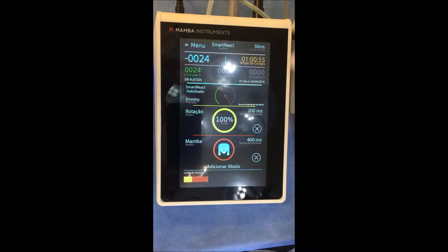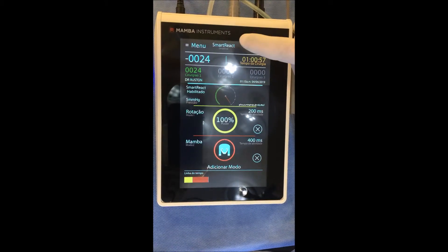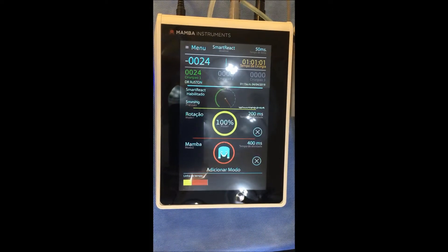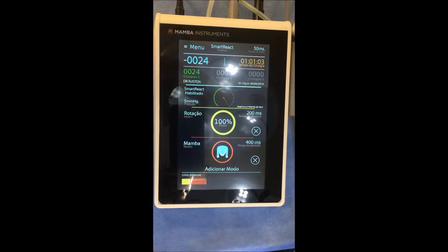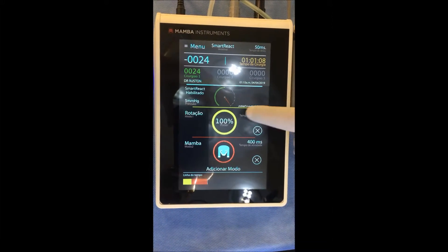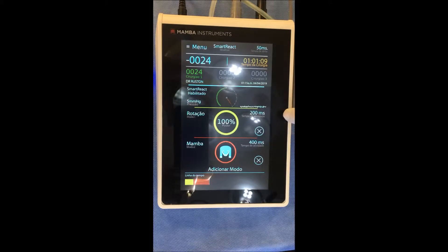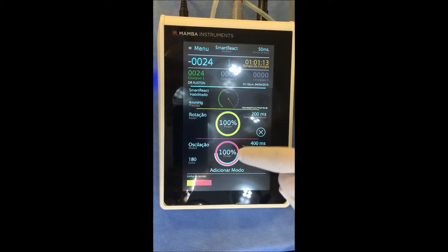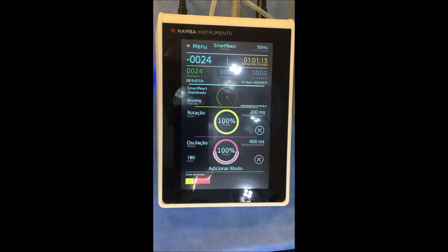So this is my personal setting: smart reaction at 50 milliseconds. But I repeat — to go this fast, you have to have a lot of skill and practice, so I would suggest decreasing little by little, starting with rotation 200 milliseconds plus mamba or oscillation with 180 degrees.